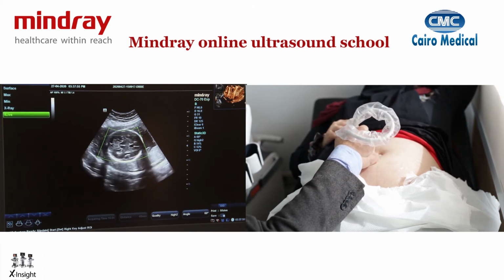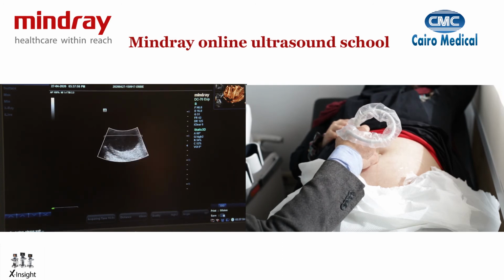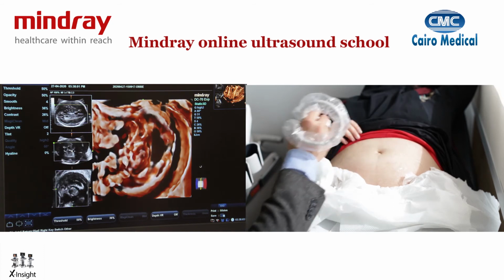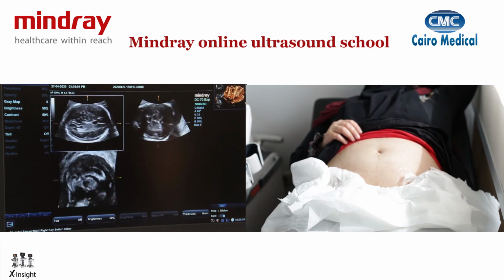So I'm just asking the mother to stop breathing because she's moving the image quite a lot. And I'm going to take a volume of the baby's head. So now I have a volume of the baby's head. I'm not going to be using surface rendering anymore, but I'm going to be going inside and using what we call multi-planar imaging. And with that, I know that I have the 3 reference images, the A, B, and C image, and I can actually move across all the structures.